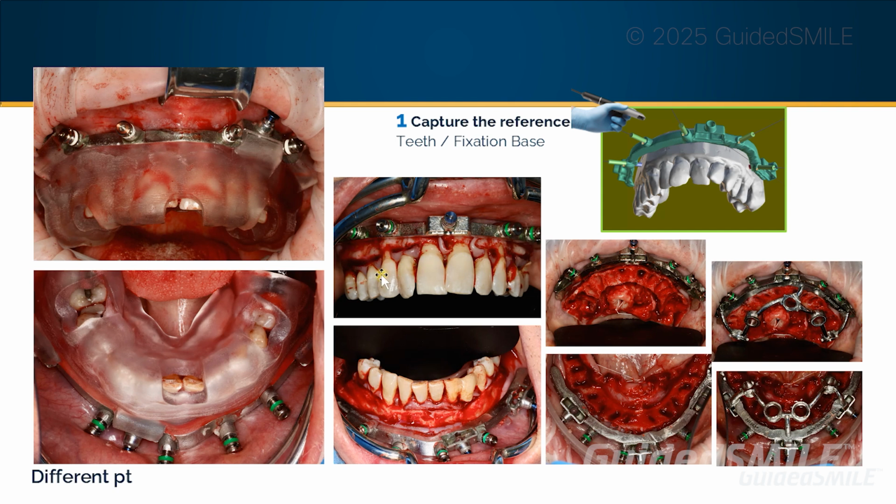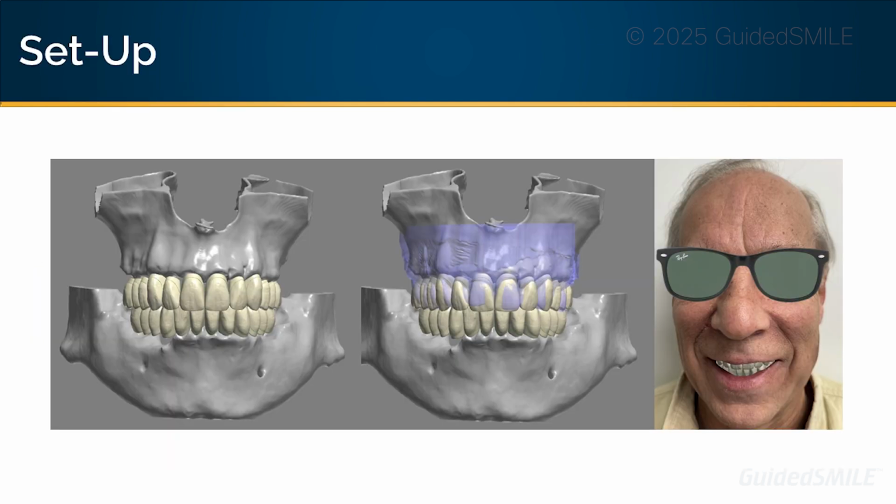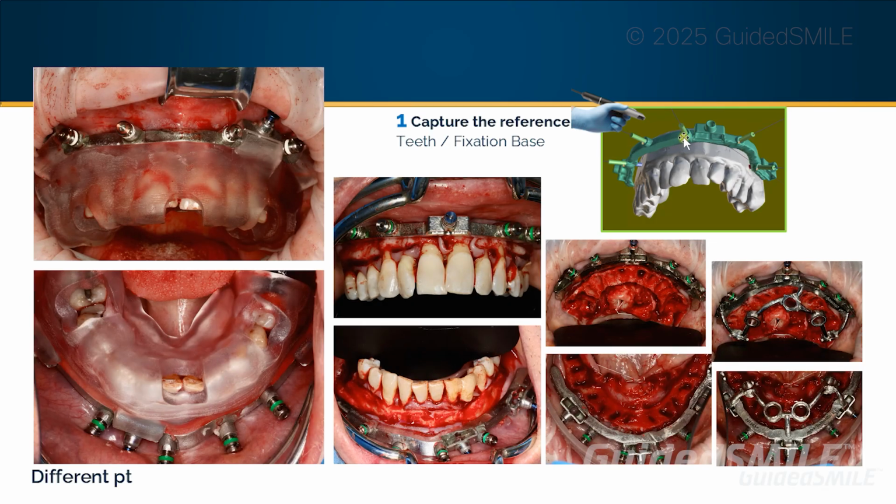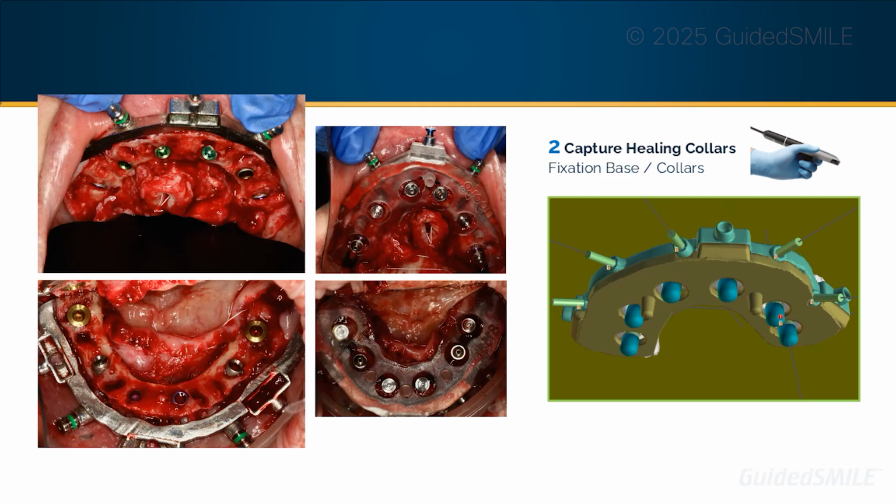Capture an iOS scan of the teeth and the fixation base. All right, you don't have to scan 360. I mean, you don't have to scan all the teeth, the lingual, because we already have the teeth and the bite back in the lab, right? We already have it at the laboratory. So all you really need to do is pick up your breadcrumb, which is the fixation base. All right, rather than using TADs, you can use the fixation base. And we at the lab will roughen this up so it's very easy to scan. All right, so that's scan one.